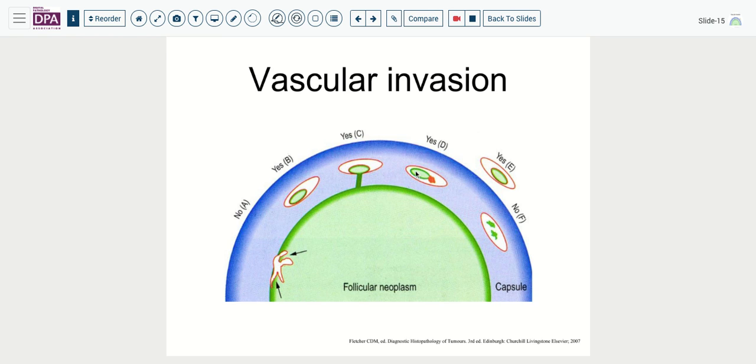If you see a little thrombus and tumor, thrombus, fibrin, blood cells, etc., associated with tumor in a vessel, yes, that's okay. Outside the tumor, yes, that's okay. Tumor fragments, no blood fibrin attached, no endothelial attached, could be artifact. So we don't call this a vascular invasion. Likewise, vessels within the tumor that are ectatic and may have indentations or ingrowths of tumor don't yet qualify as vascular invasion. So those are helpful criteria.